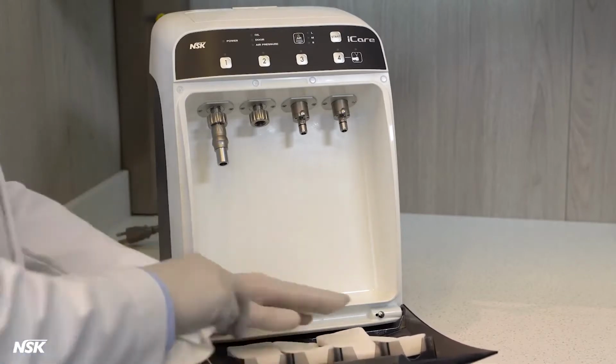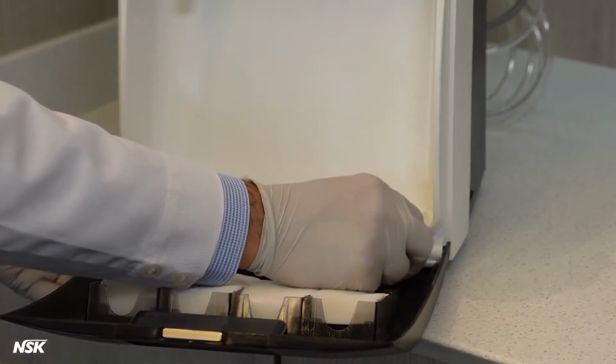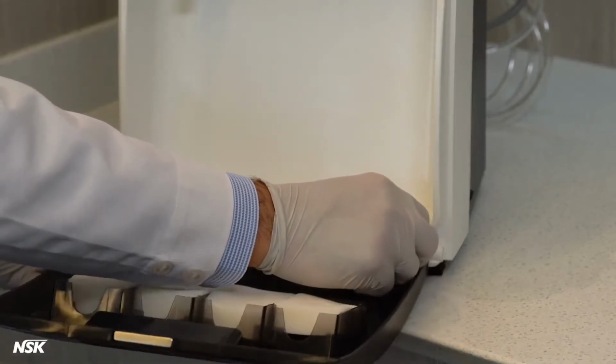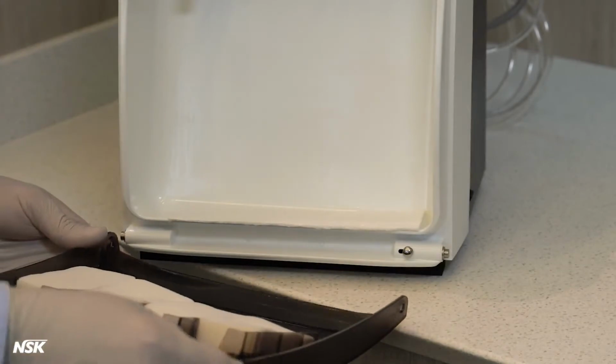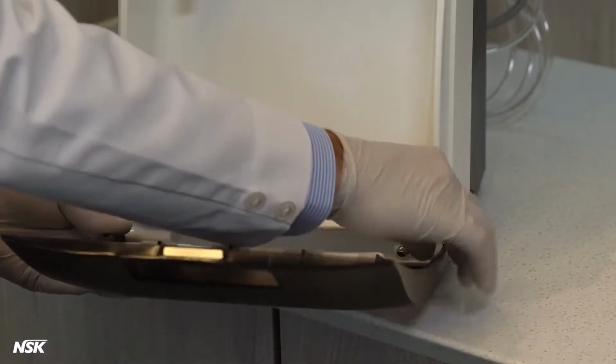If you need to remove the front door, slide in the latch lever at the lower right corner of the door and pull out the door. To put the door back on, fit the installation hole and the pin on the left side first, and then lock in the door by pulling and releasing the latch on the right side.